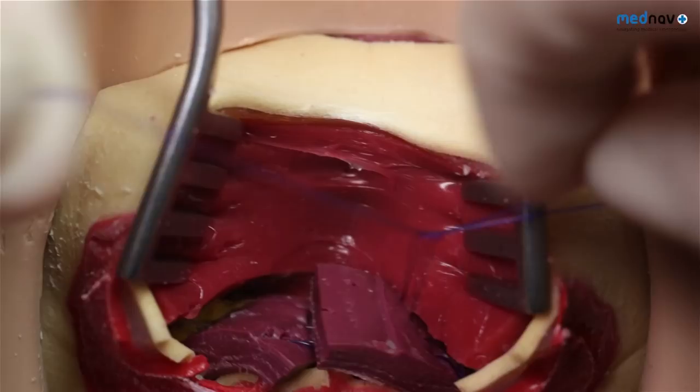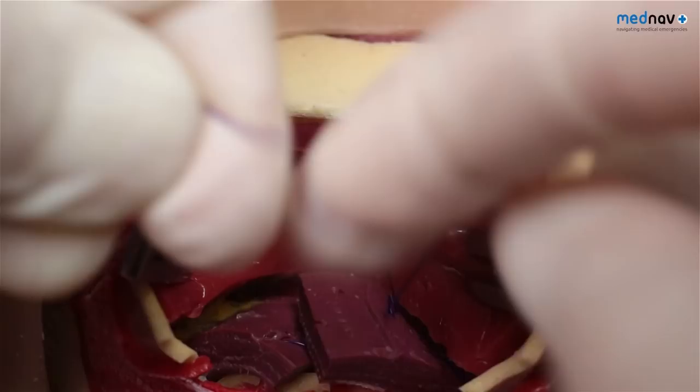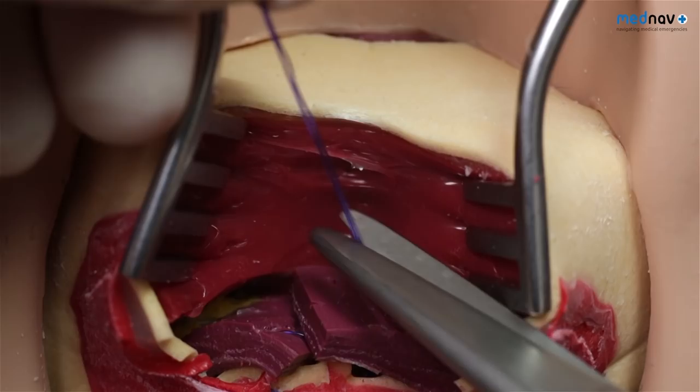When you've placed both stitches, tie these stitches. Similar outcomes have been seen for the repair of the external anal sphincter with both the end-to-end stitch and the overlap double-breasted stitch technique.